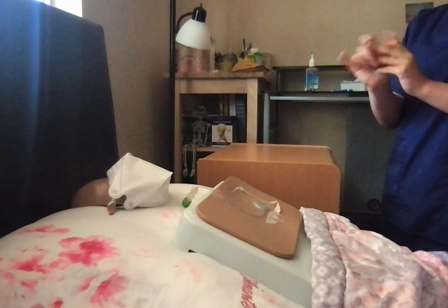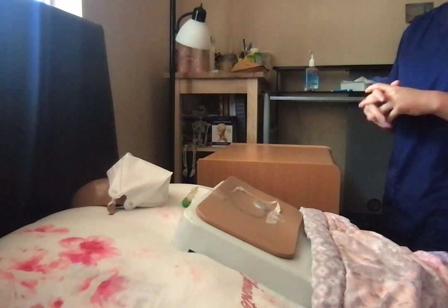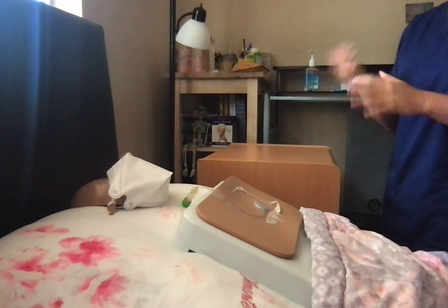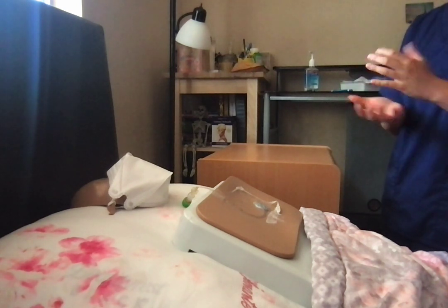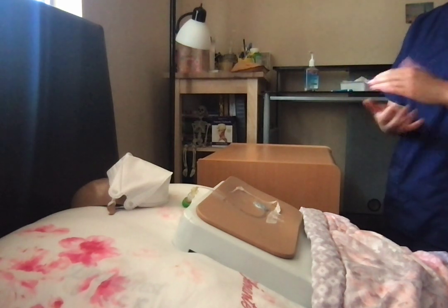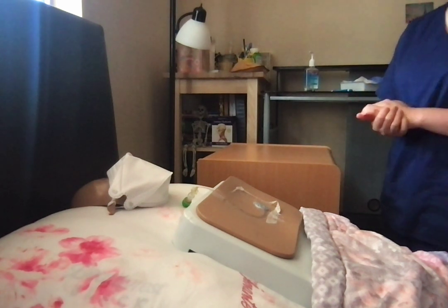While this table is drying for 2 minutes, Mr. Jones, I will ask that you turn your head to the side during this procedure. This is to prevent any risk of contamination. This is also why both you and I are wearing masks — to reduce the risk of any contamination at the CVAD site. Can I assist you in turning your head? Thank you.